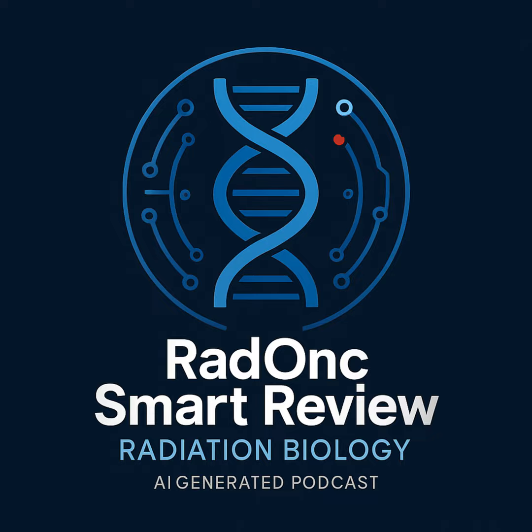For CT contrast agents, lock down iodine, barium for GI, and crucially, remember, gadolinium can also provide CT contrast, not just MRI contrast. High Z is the key. Got it. Pearl number 2, the core physics of PET scan. Remember positron emission leading to annihilation with an electron, producing 2 511 keV photons flying off at 180 degrees, detected by coincidence. That's the sequence.